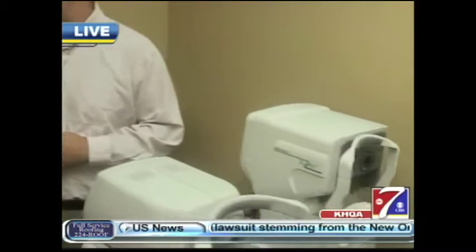Ryan Hewlett joins me to explain what people come to after you fill out the paperwork. This is the first stop. Yeah, this is the pre-test room. If we're talking about kids, they come in for an auto refraction, also to do a stereo and a colorblind test. We check color blindness mainly in males, but it can come in females as well.